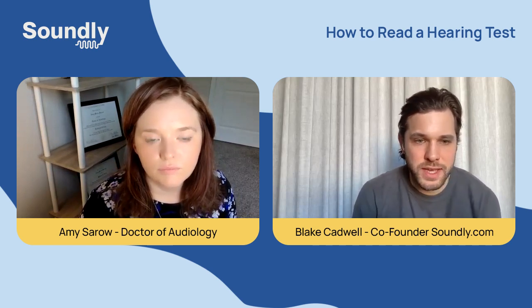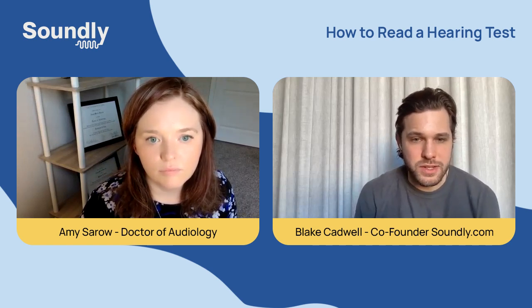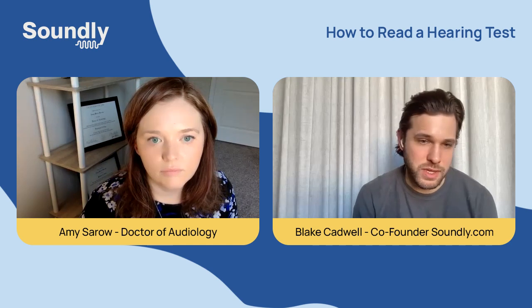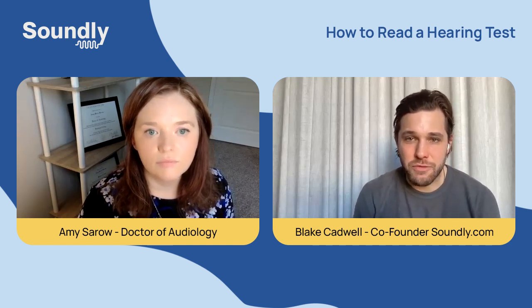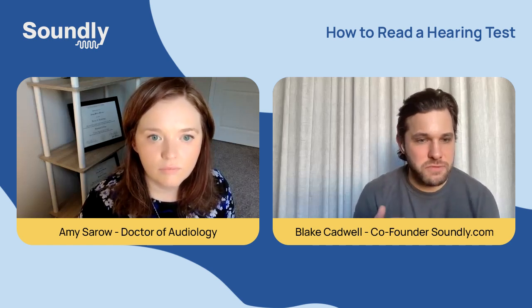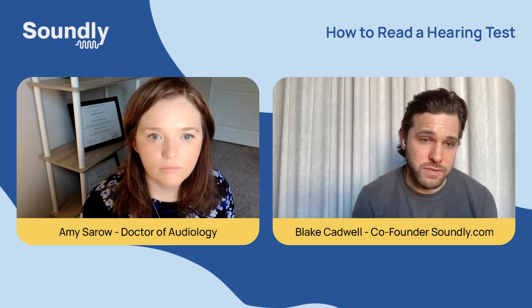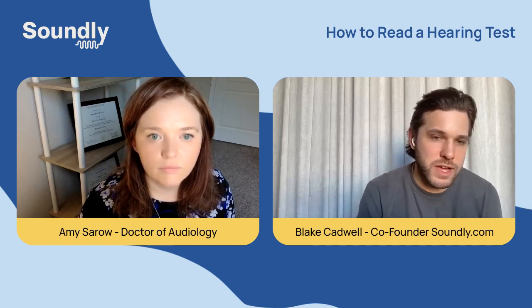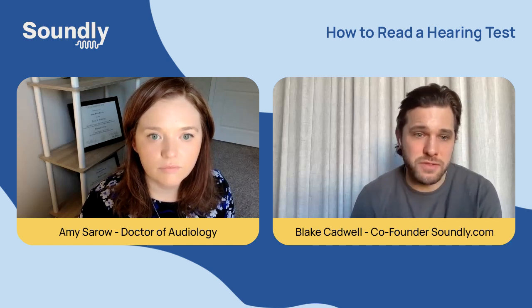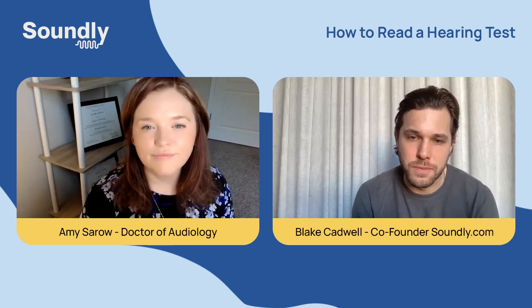It's important to note that an audiologist or a doctor can be really helpful in the specific treatment of your particular hearing loss. If you take away one thing from this video, it should be that every hearing loss is quite a bit different. There are patterns that emerge, but the severity and the steepness of a slope can change by each and every individual. And so that's where working with a professional to get a prescription device that's customized to your hearing loss can be really beneficial to so many people.